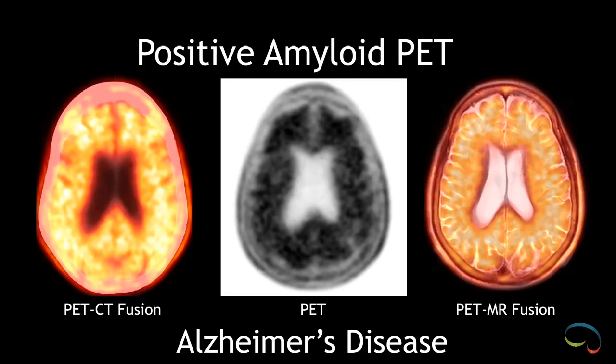This shows the amyloid PET study with PET-CT fusion on the left, the PET image in the middle, and the PET-MR fusion to an axial T2 sequence on the right.